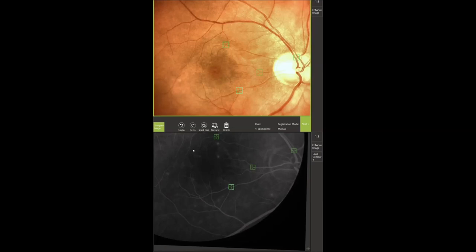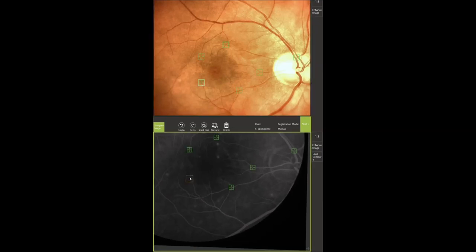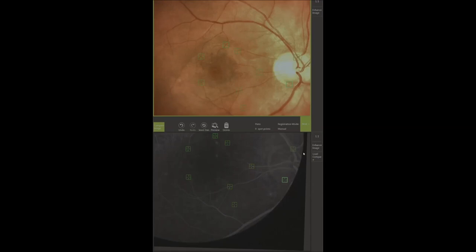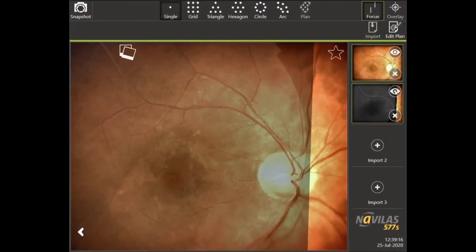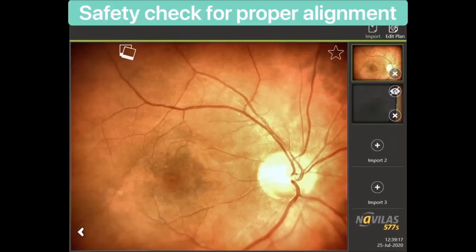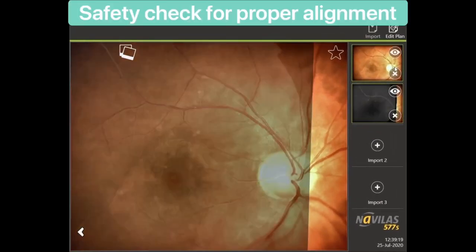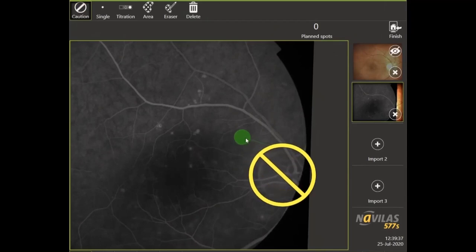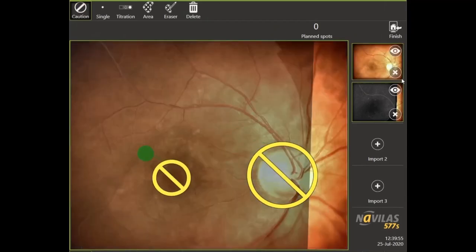The corresponding dots were applied encircling the area of future treatment. Then the alignment was checked by controlling the correspondence of vessels on the fundus image and the fluorescein angiography image. The aim was to exclude shadows from FA vessels on the retina aside from the vessels on the fundus photo, as shadows present could be a sign of improper alignment.